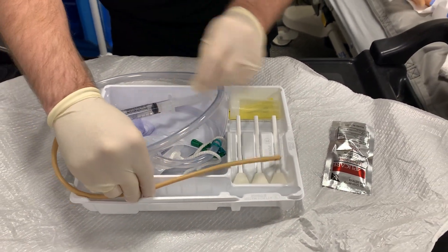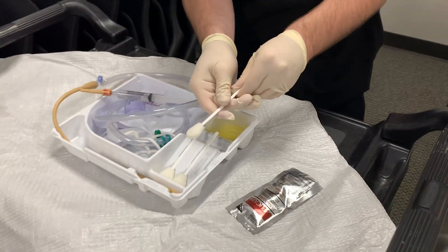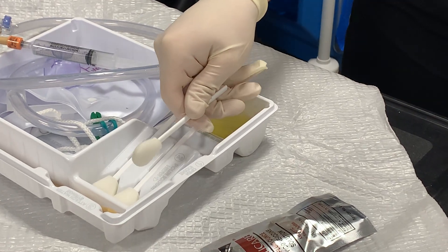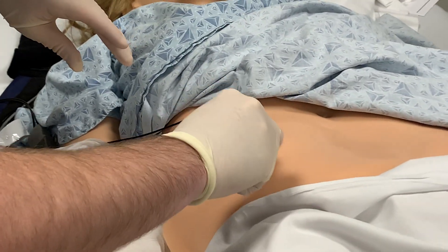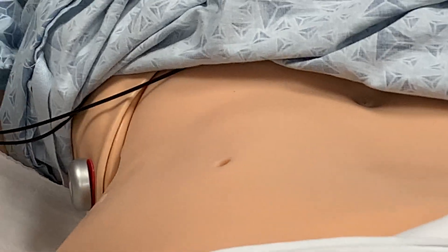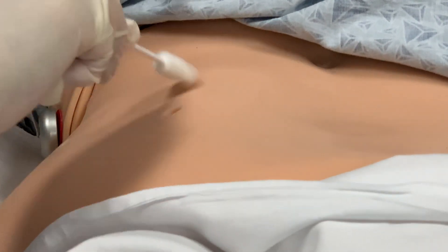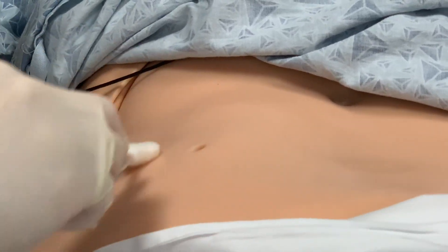Different catheter tray systems have different tools for cleaning — this one has swabs, but you may get cotton balls with tweezers; either works fine. To clean, we will start with the betadine, beginning right at the urinary opening and moving in circles outward, not covering the same area twice. We will discard the swab and repeat, starting again at the urinary opening and going in an outward motion, again not covering the same area twice — three times total, and we are done. Ready to insert our catheter.